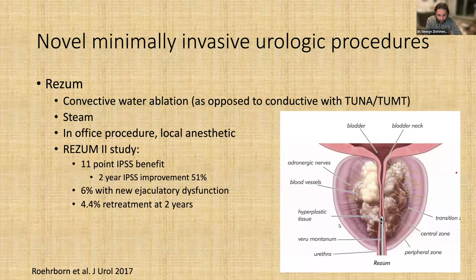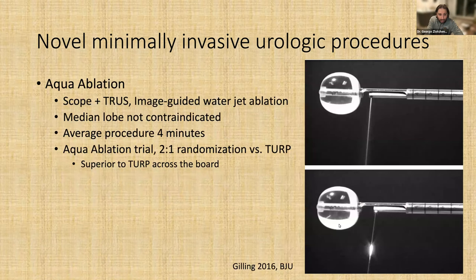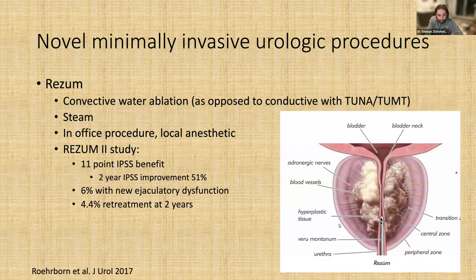Rezum, this is similar to ablation. It uses steam to ablate. So water and steam, also can be done in the office. The Rezum II study showed an 11-point IPSS benefit, 2-year improvement 51%. I guess we don't have any long-term data yet. 6% with new ejaculatory dysfunction and 4.4% had retreatment at 2 years. Aquablation, I don't really know the difference between that and the Rezum, but that's another minimally invasive procedure.